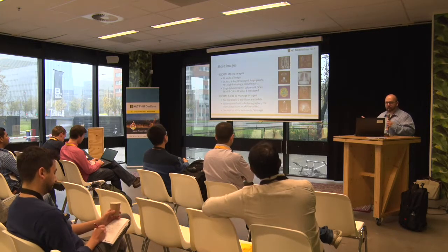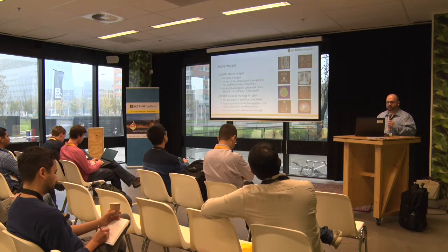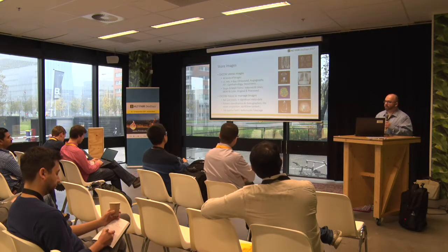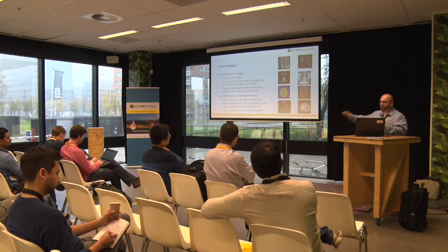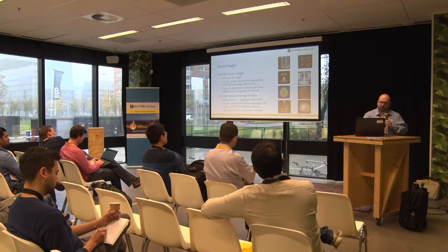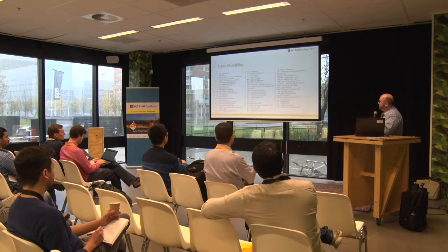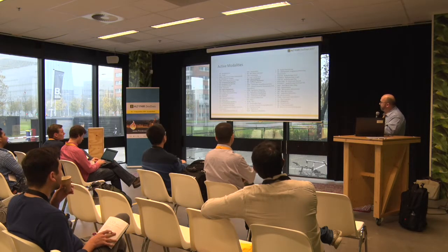So as I mentioned, DICOM can store images, all kinds of images from all different kinds of modalities, and it stores metadata about it. So not just the pixels, but significant metadata. Like for example, the patient's lying on the table, we store the table position as the patient moves through the unit. We can query on this data, we can sort it, we can route data to different destinations, we can manage the data. There are many different modalities. I've bolded a few that you might recognize, like CTs and MRIs and mammograms, but you can see that we actually acquire images from all sorts of different modalities.